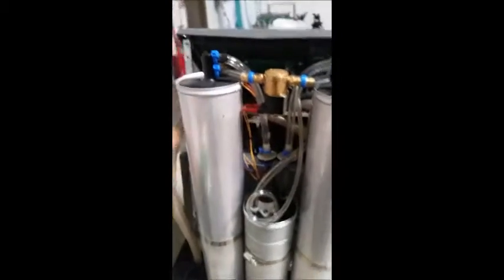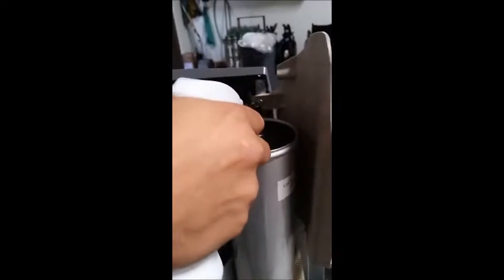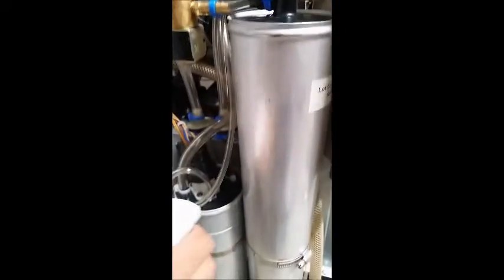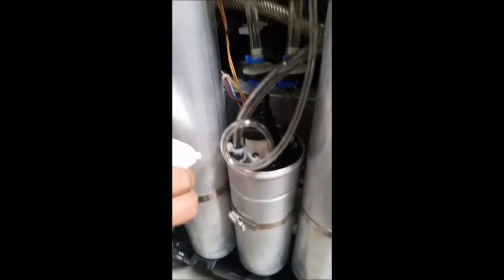To detect the leak, we're going to take our Simple Green and spray it on the different connection points on the concentrator and look for bubbles. So far there's been no leak.